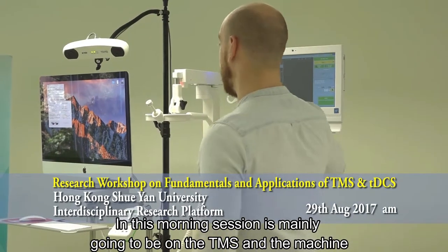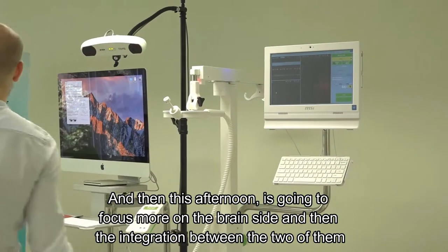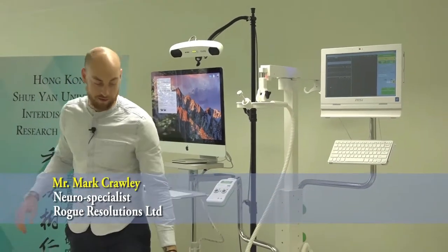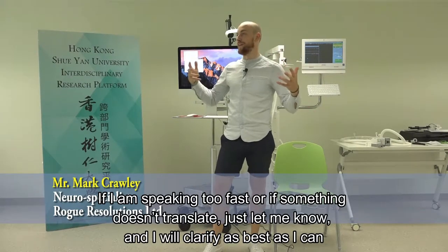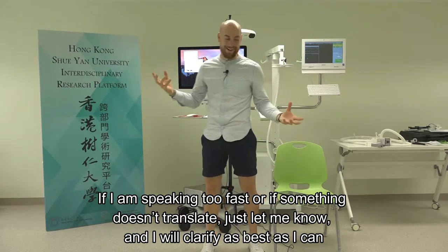This morning's session is mainly going to be on the TMS machine, and then this afternoon is going to focus more on the brain site and the integration between the two of them. If I'm speaking too fast or if something doesn't translate, just let me know and I'll clarify as best I can.